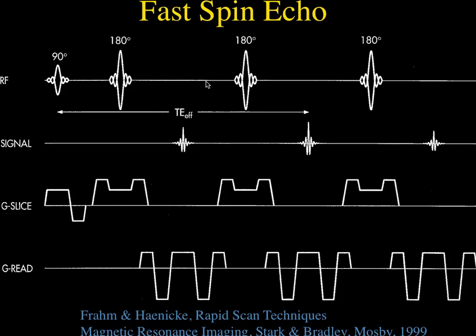And you can do that now because we can do this imaging so much more efficiently. But then again, you'd want to center the K-space values around a relatively short TE. A lot of people won't use the shortest. They'll use something more around 30 milliseconds for various reasons. And if you want a T2 weighted image, you would take the high ends of K-space sooner, and put the center of K-space out at a later TE, say 60 to 80 milliseconds.